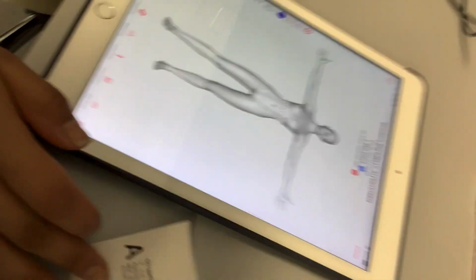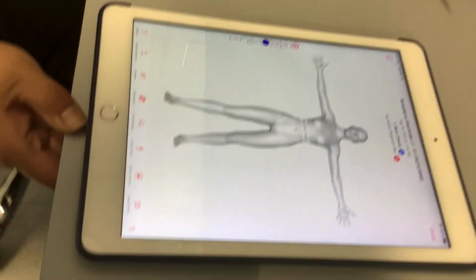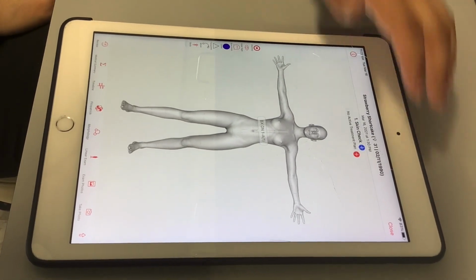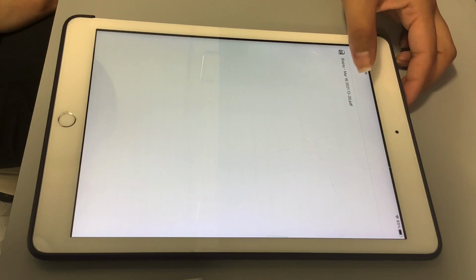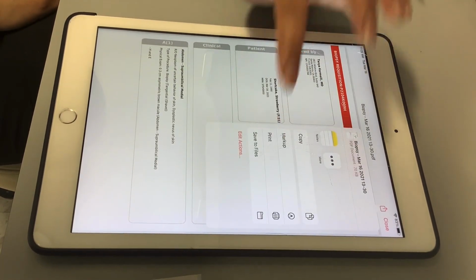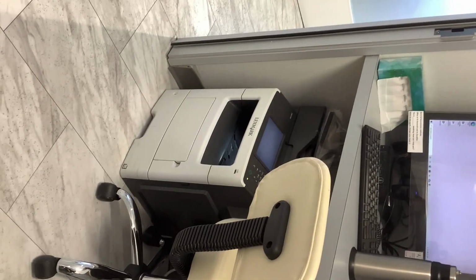There we go. You can see that there's the patient's name, date of birth, the exact location of the biopsy, and today's date. Additionally, we need to have a requisition sheet to accompany this biopsy, which would go to their progress note. We would go under forms, go to requisition, biopsy for today, click, print, and we want to switch back to lab. This is not a label, this is actually a piece of paper, and it will come out in the printer. Next, you have to log in the biopsy.